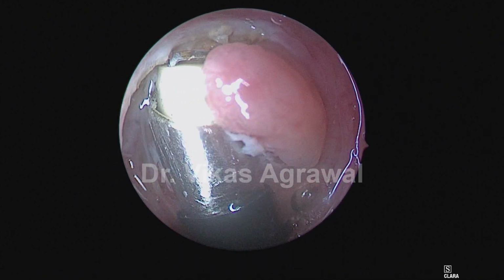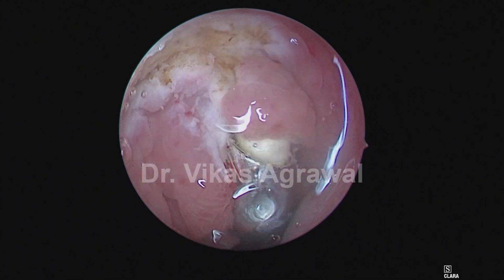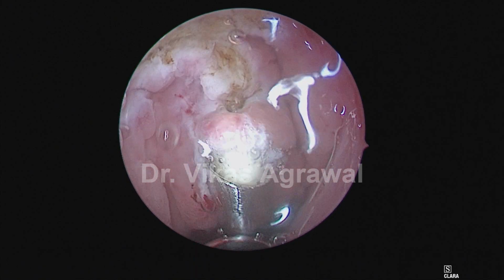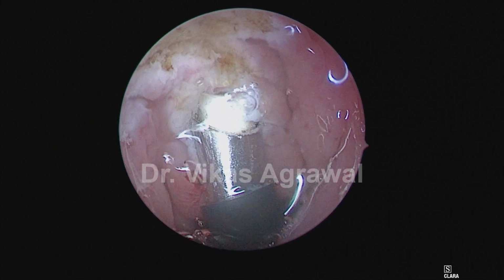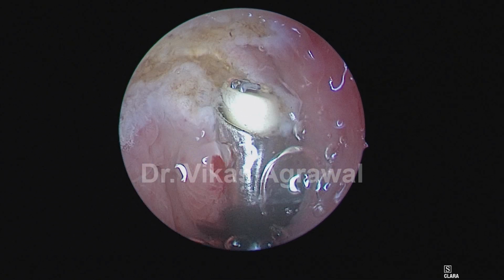And that's the superior boundary. As you can see, there's hardly any space for me to move my wand. So the dissection is obviously pretty slow. That's all right.